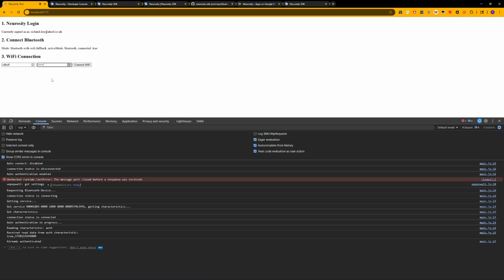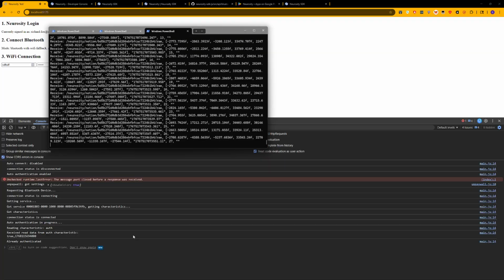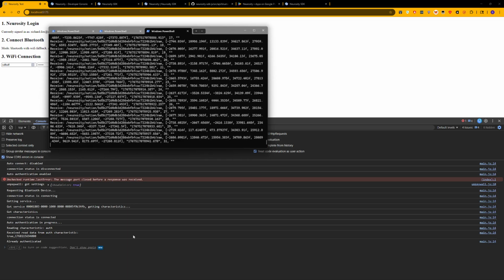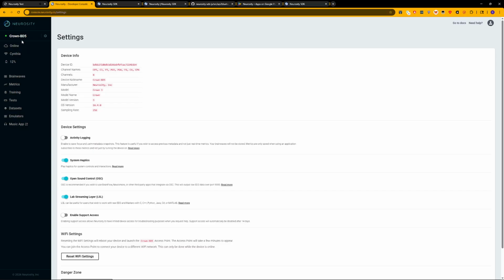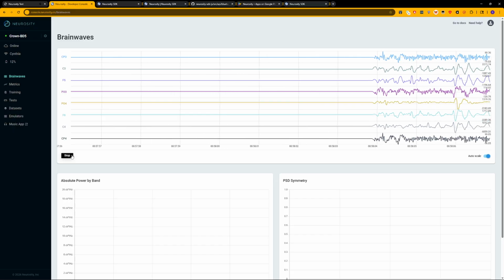You type in the details, and then you hit connect, and it sends a Bluetooth message directly to the headset saying, here is the Wi-Fi I would like you to connect to. And when I got that correct, the LED on the back of this device turned from blue, which means searching for Wi-Fi, to white, which means Wi-Fi. And the actual target application that I'm looking at, which is OSC, immediately started to work. I have no idea what this OSC data is, but it surely is a lot of numbers. We can actually go to the developer console here, go to Brainwaves, hit start on here, and you can see it's working. That's great.